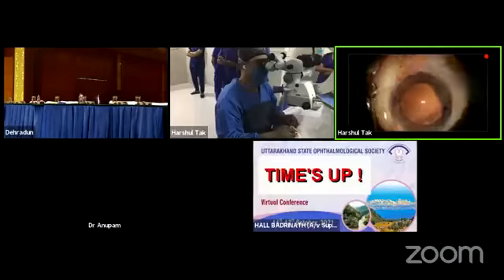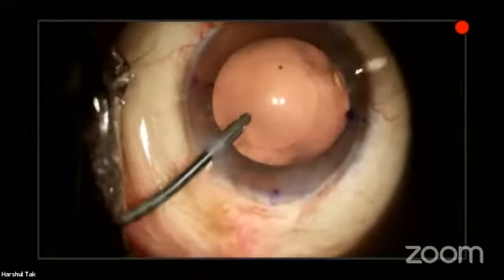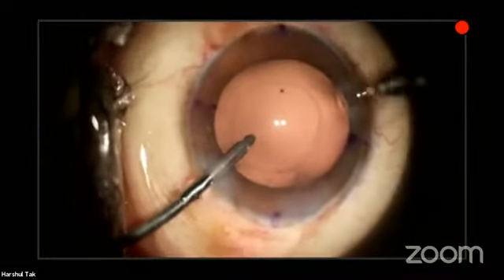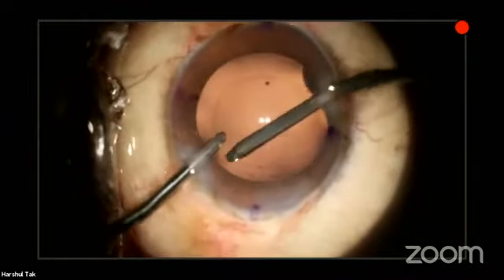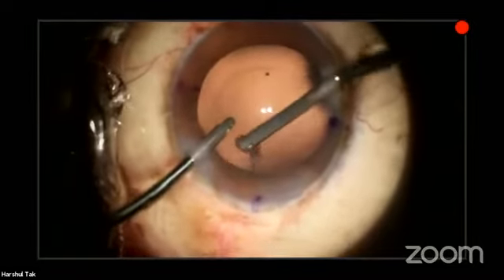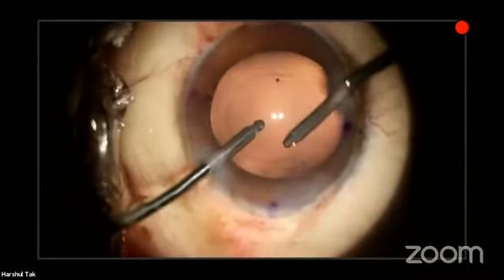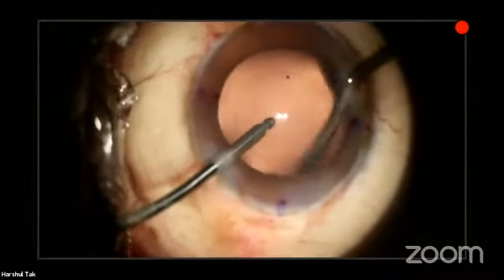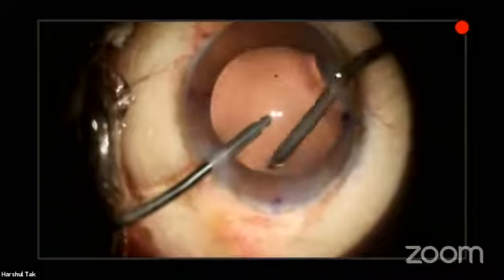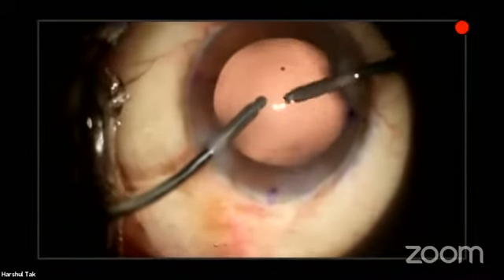Okay, so see the light mein dekhenge. Bahut acha hai na, very good. I go on IA two more and take off this. So it's important to clean up the entire capsular bed nicely. So you go and implant the IOL.